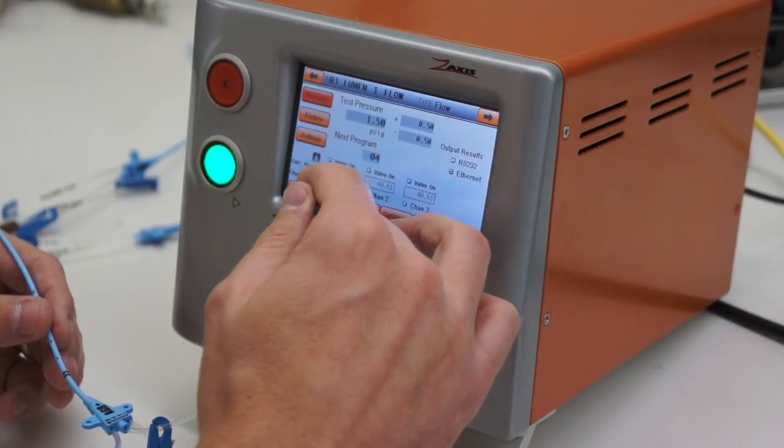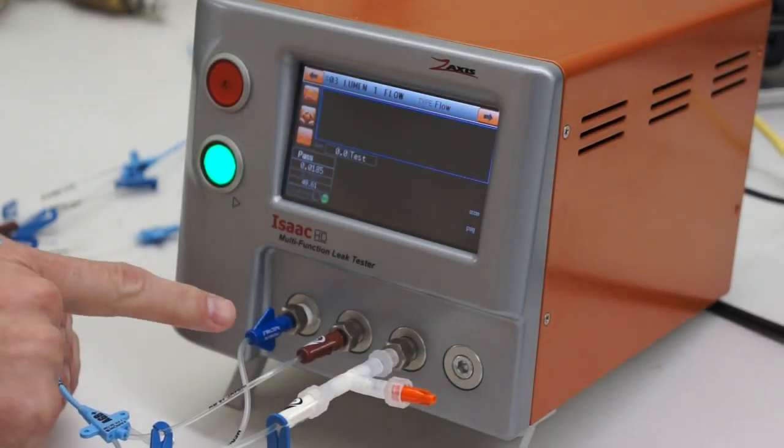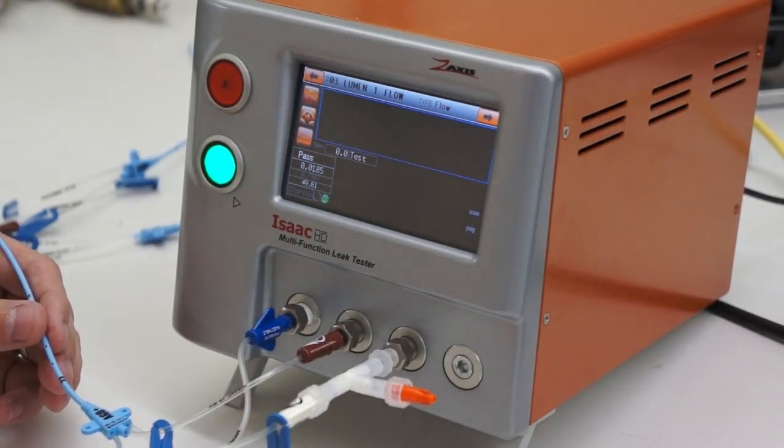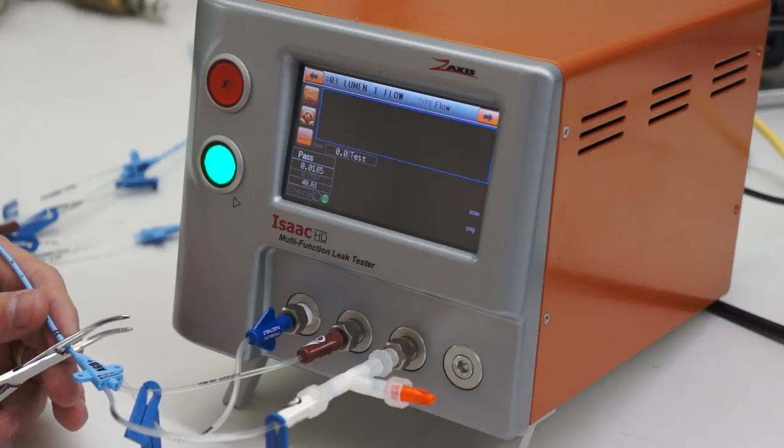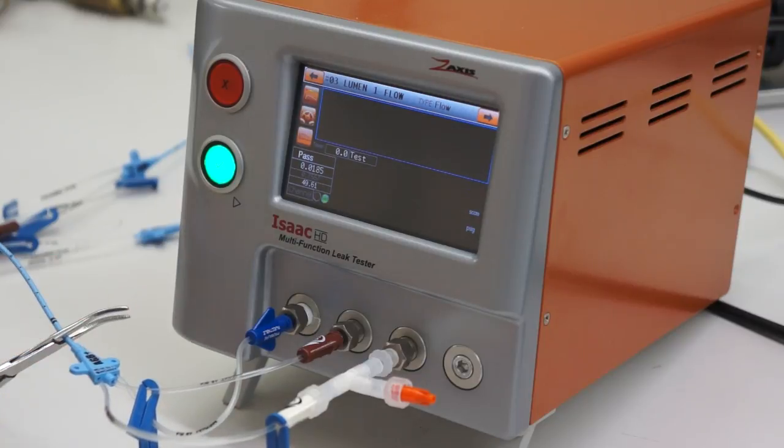We start on the flow tests. We will do three flow tests, one for each lumen. Then I will occlude the part with a set of forceps, and it will do the leak tests.